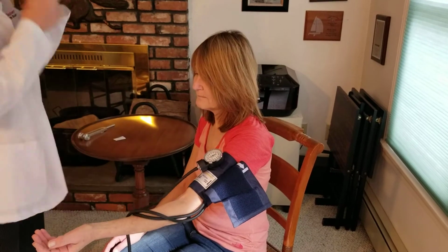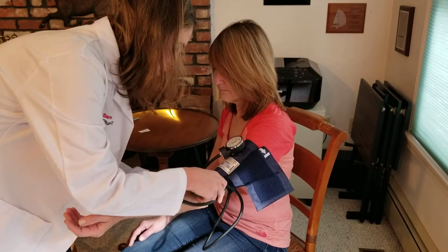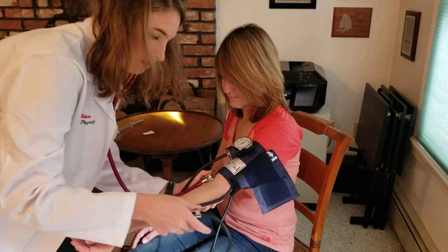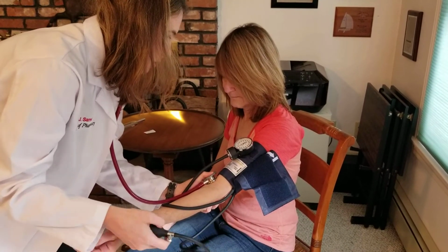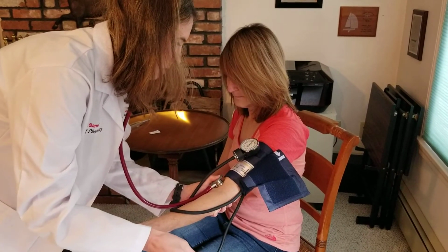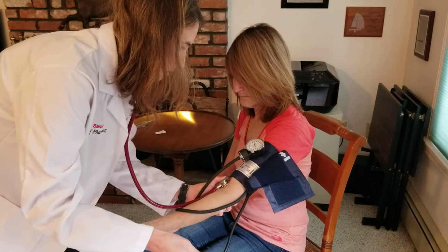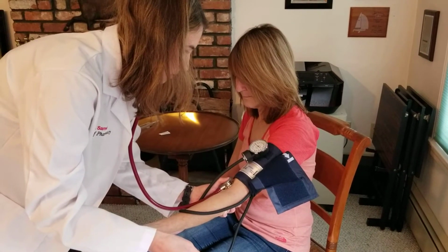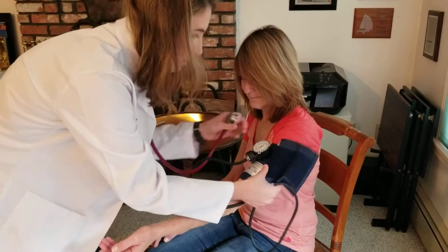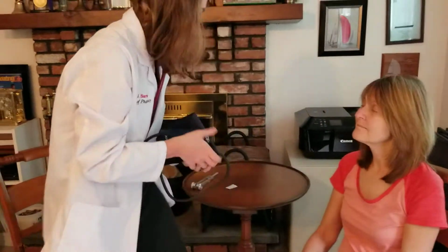So again, I'm going to put the stethoscope on and put the bell on the brachial artery. Have you just relax your arm a little bit there. Okay. So again, I'm going to pump this up to 20 to 30 above, and then slowly release 2 to 4 millimeters per second. Okay, so that was about the same. It was 120/65. Okay, so thank you for that.